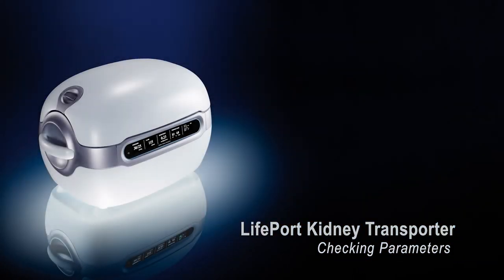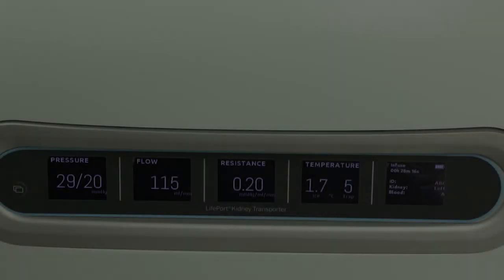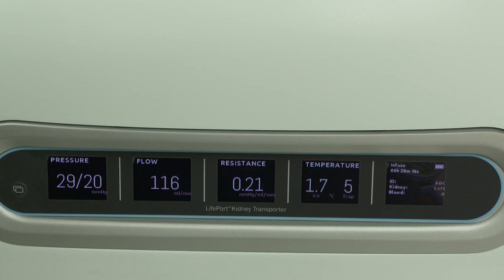Checking parameters after infusion is commenced. The display screen of the Lifeport Kidney Transporter will provide comprehensive information about the kidney. On the left-hand side, you can find the set pressure and the pressure the machine is achieving during perfusion, as well as your current flow rate, renal resistance, and two temperatures. The first temperature is that of the ice and water surrounding the kidney; the second is an approximation of the solution temperature flowing directly into the kidney. Over the first approximate hour of perfusion, you want to see flow increase and renal resistance decrease. If this isn't happening, consider adjustment of pressure depending on kidney quality. A toggle button on the left-hand side will display trend lines of flow and resistance over time.